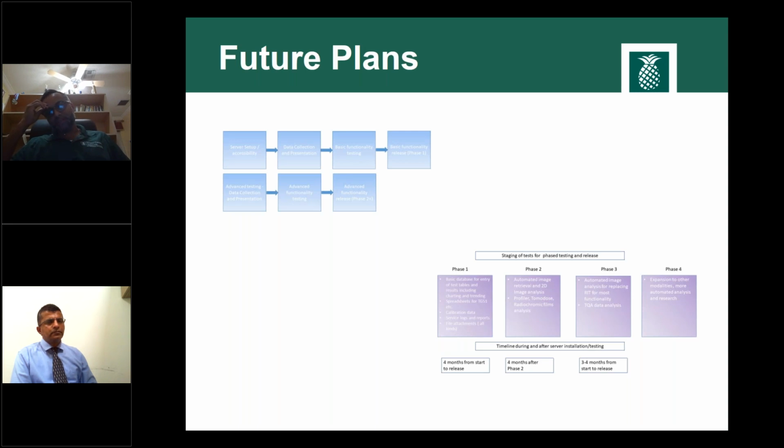As I mentioned, after a lot of research, we decided to go with QA Track Plus, and by the end of this year, we are going to commission one more machine in the September-October timeframe. So we are going to wet our feet with the new QA program, QA Track Plus. Once that machine is set up there, and the QA program for the new machine is set up, tested and analyzed, we are going to clone that to all our existing machines and other programs.